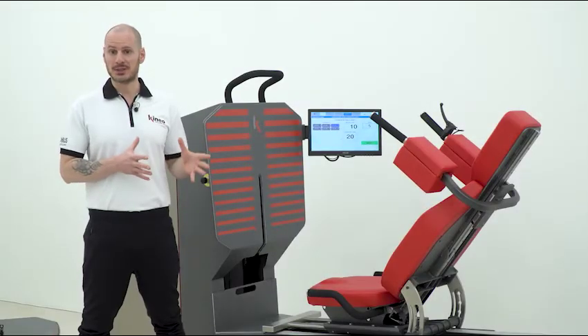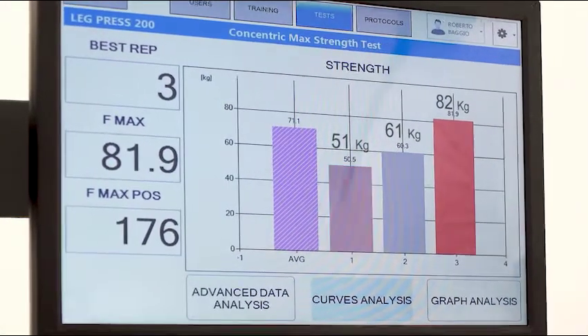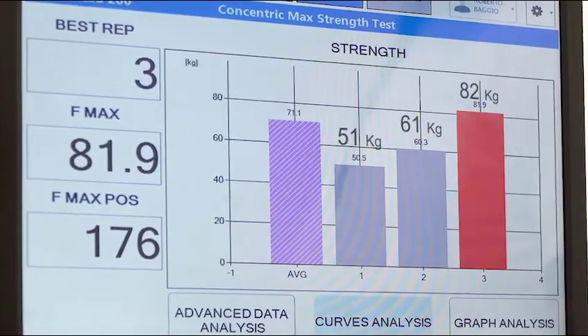We can see that, depending on the speed attained, the subject reached 51 kg in the first repetition, 61 kg in the second, and 82 kg in the third.